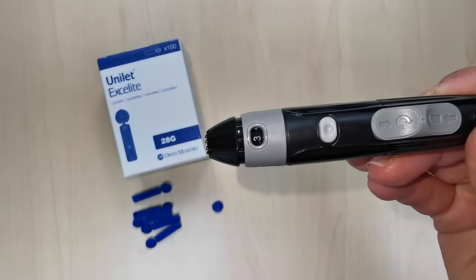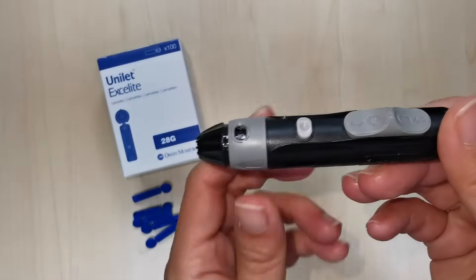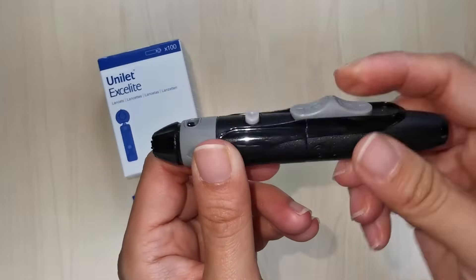Lastly, prime the lancing device by pulling back on the slider until you hear the activation button click. You are now ready to perform a finger prick.